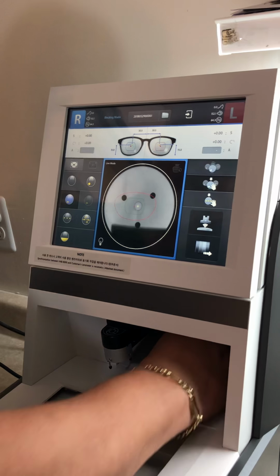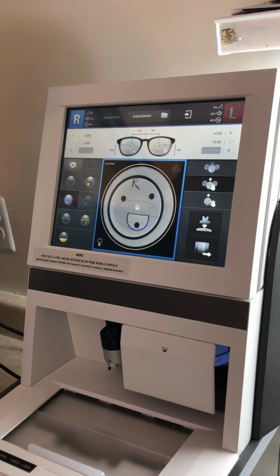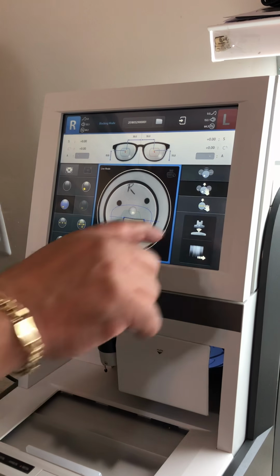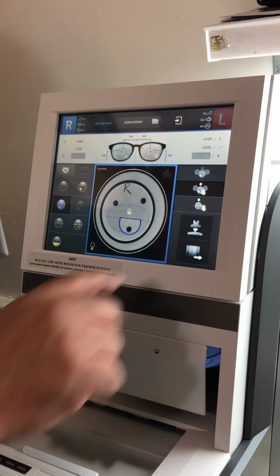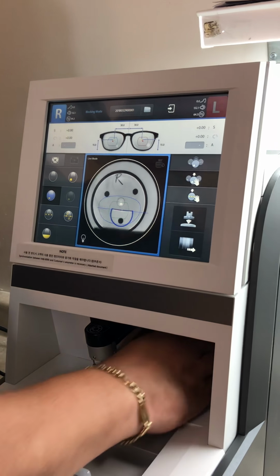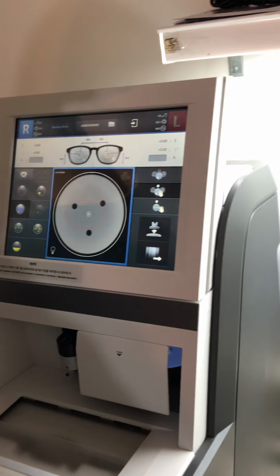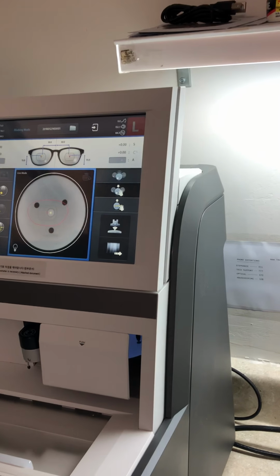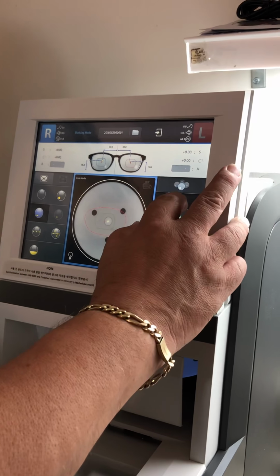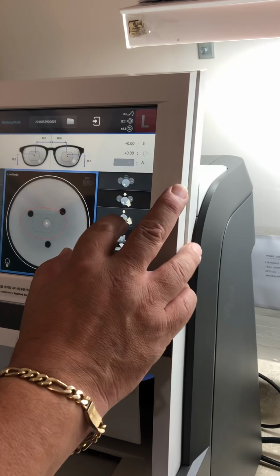And then it'll also tell me, once I'm there, to block. See how the blue right here has a picture of the block? I want you to block it. So that's where we're at. These are the different modes we can block in. This is intelligent mode. I have it defaulted to auto, and then this is manual mode.